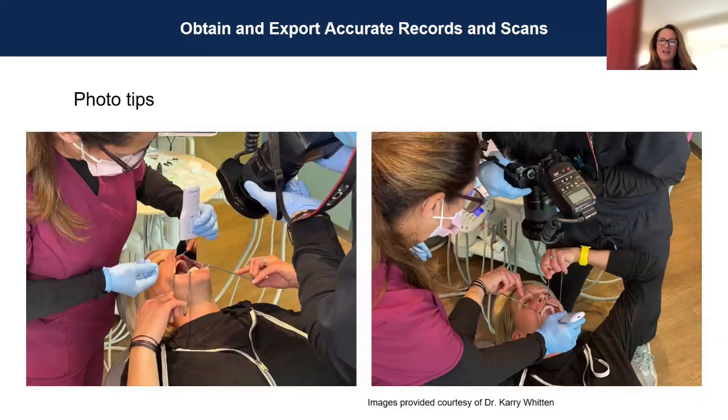So here is the positioning, like I said, and there's that mirror that has a fan on it. I wish I had that years ago instead of having to put hot water or put it under a heating pad. So right here, we're taking the shot of the mandibular arch. And on the other one, we're doing it for the maxilla.